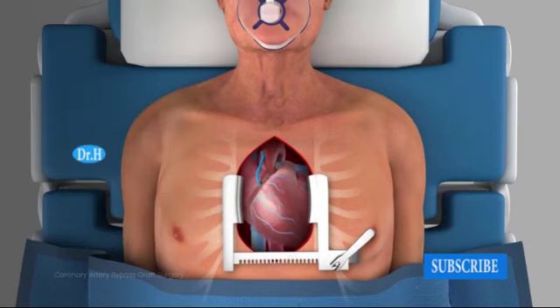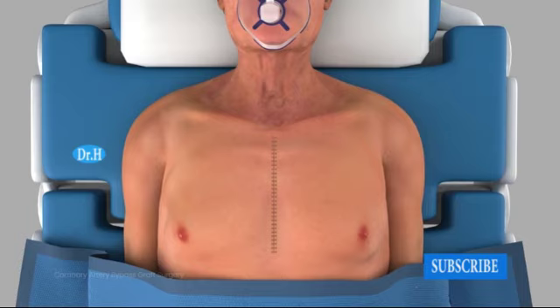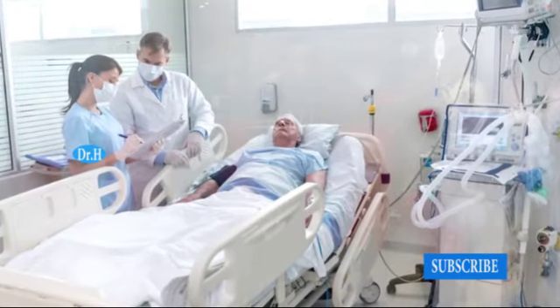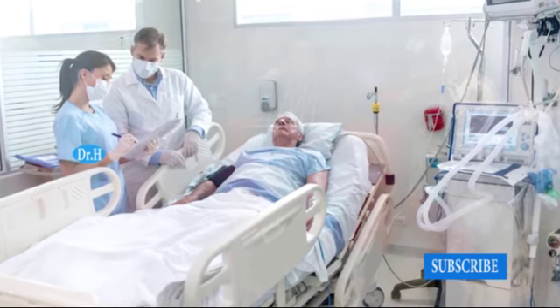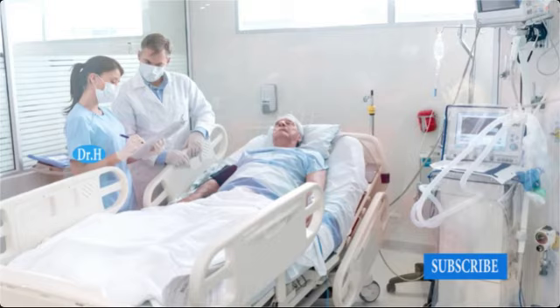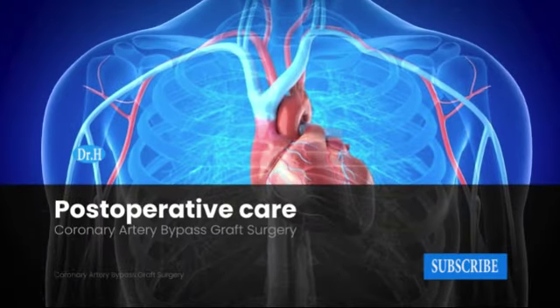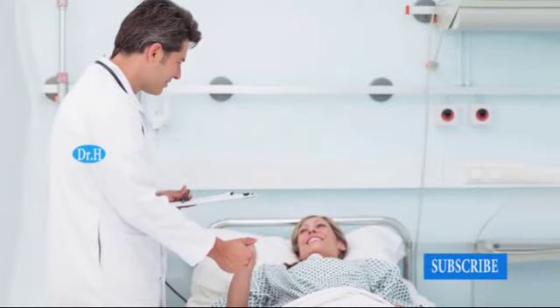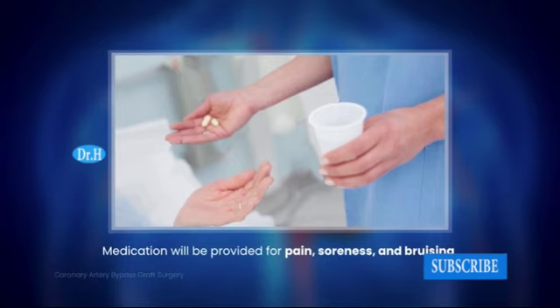After the bypass graft is established, blood flow through the heart-lung machine is disconnected and circulation will be restarted through the heart. Finally, the incision will be closed with absorbable suture. CABG surgery usually takes about 3 to 6 hours, after which you will be transferred to the intensive care unit for monitoring.